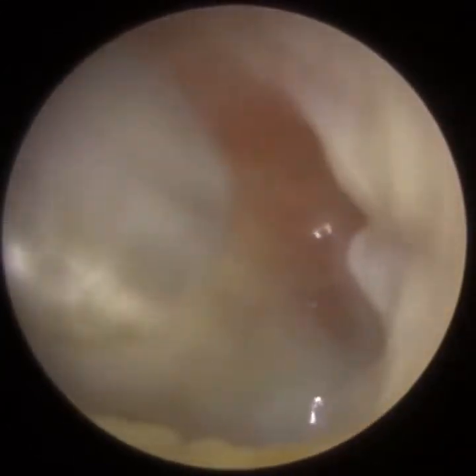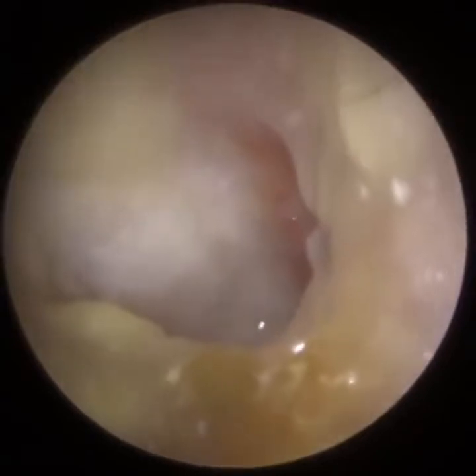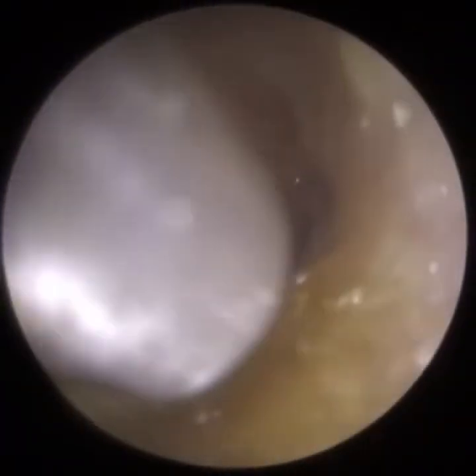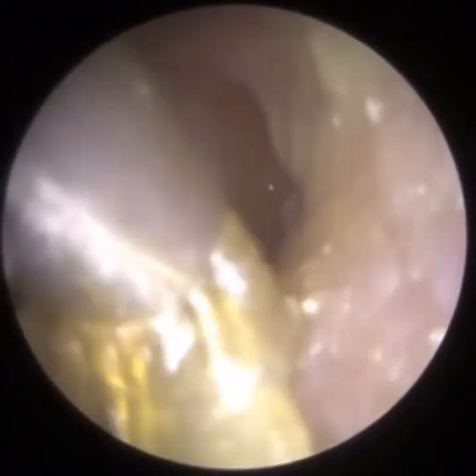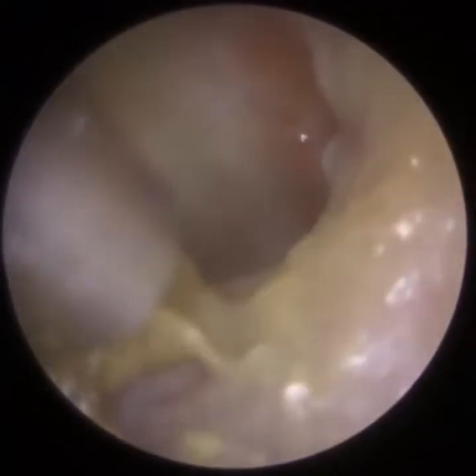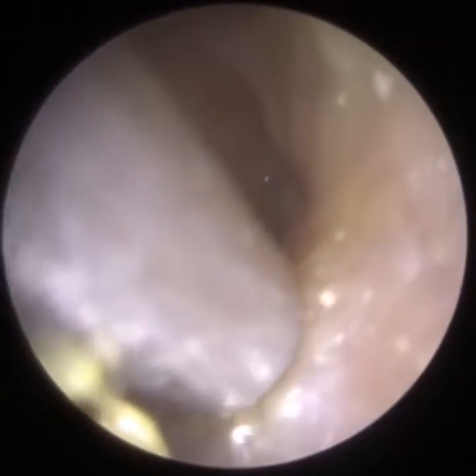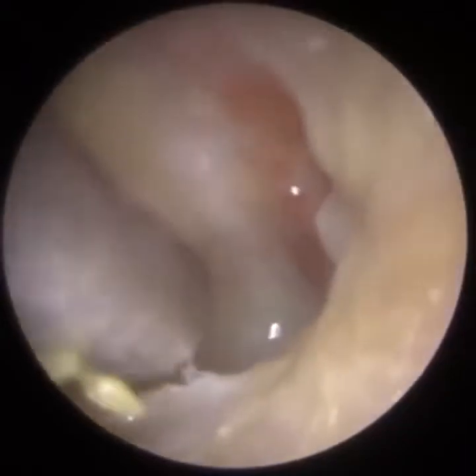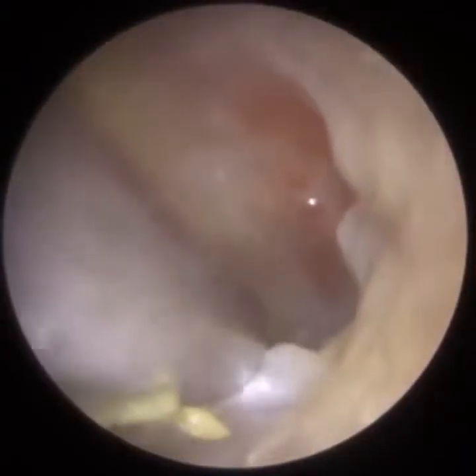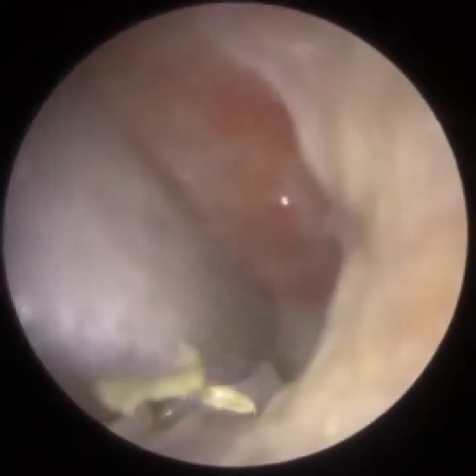I'm just slowly going forwards towards the eardrum now. I can see on the right-hand side of the eardrum the patient has got some granulation tissue. So there we are, the red bubbles. Granulation tissue can occur in other parts of the body, but it occurs when your body is trying to heal from an infection or trauma. In this case, the patient has a natural infection of the eardrum because of the otitis externa. Granulation tissue is a buildup of connective tissue that has its own blood supply. You get a buildup of blood vessels within the connective tissue, which gives it this bumpy red appearance, and it can be quite wet.